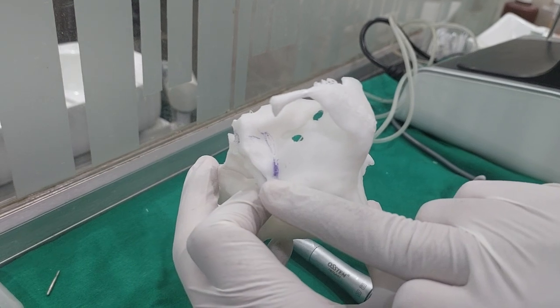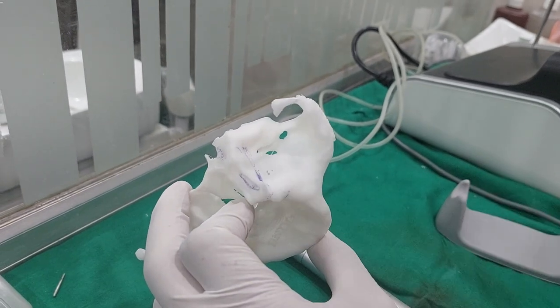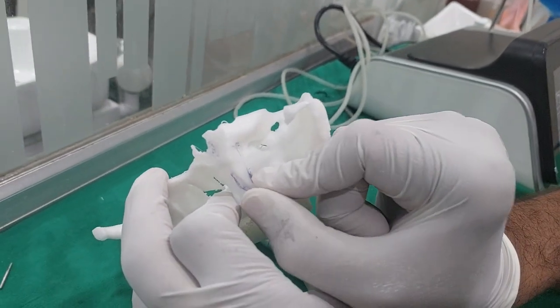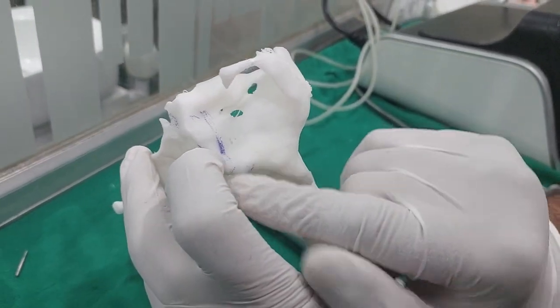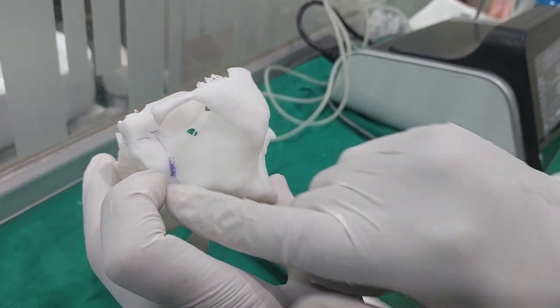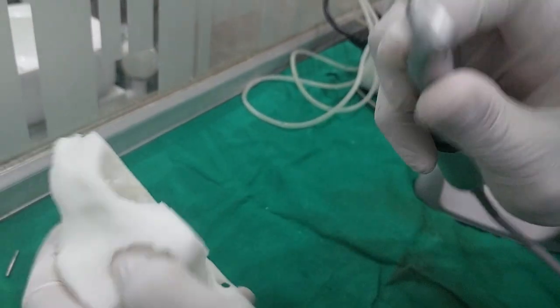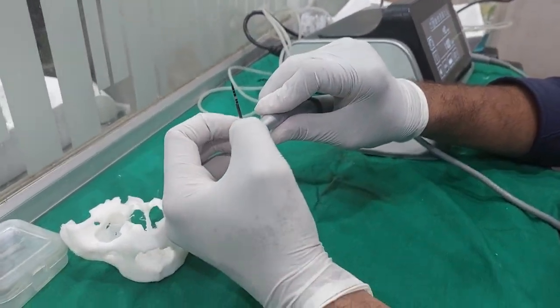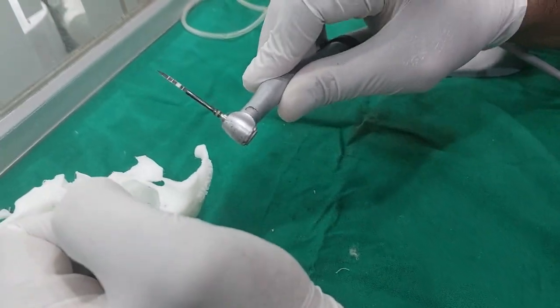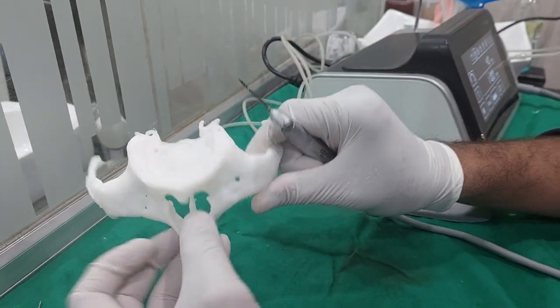However, if you pierce into the lateral pterygoid muscle, it will cause trismus, because the lateral pterygoid muscle has attachment there - the lateral pterygoid muscle is lateral, and the medial pterygoid muscle is medial. We must remain away from the lateral pterygoid muscle. Also, the maxillary artery passes lateral to the lateral pterygoid muscle in the fascia. Staying away from this is relatively easy because you are placing at an angle. The pterygoid muscle fascia is 35 mm away, so you should choose a cortical drill of only around 20-25 mm length, so that even piercing full length you do not reach the pterygoid muscle fascia.